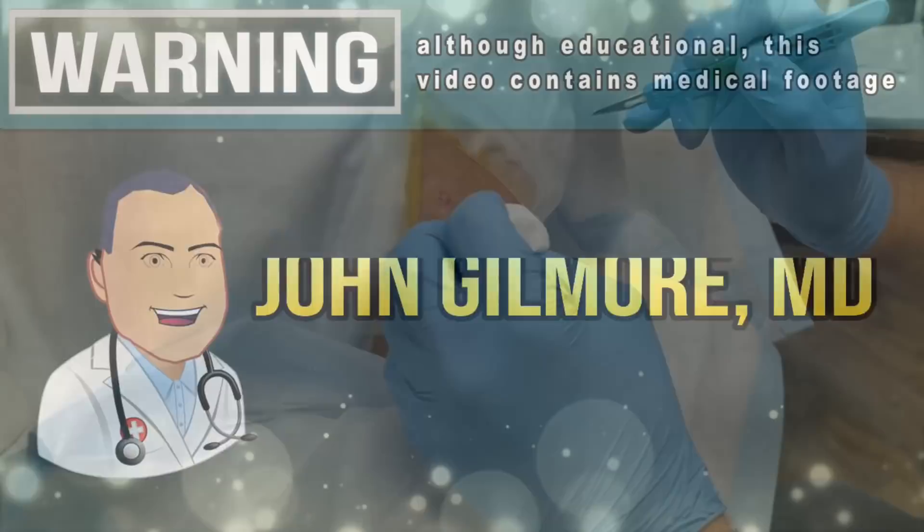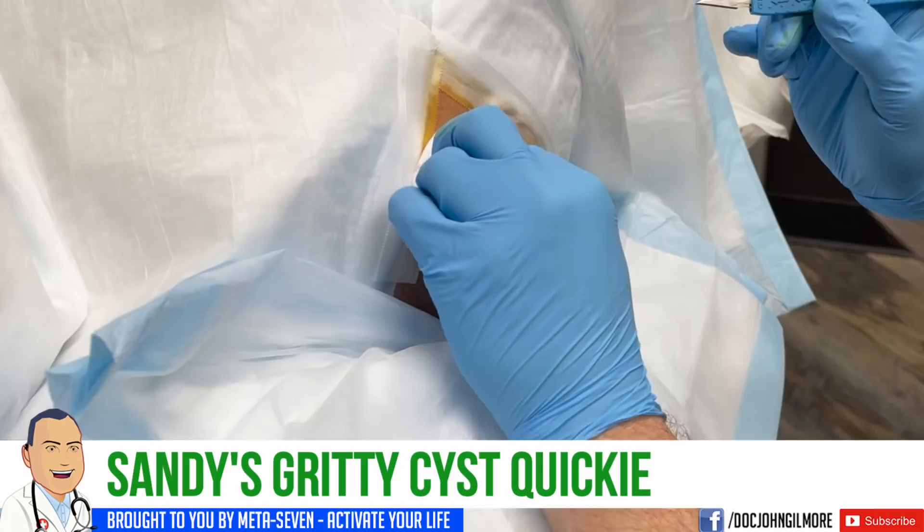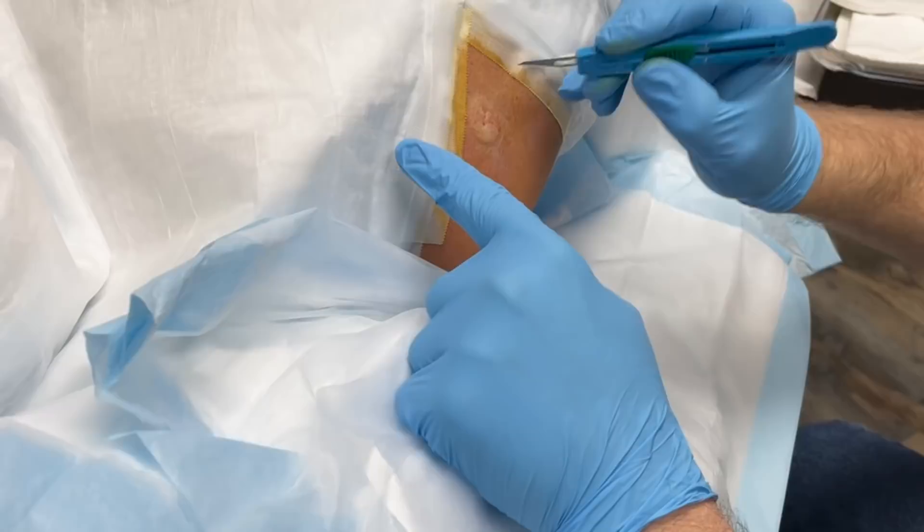So we're going to go — the arm sort of runs like this. You want to watch? You're not going to be able to. No, I can't watch. So try to relax, okay? You're not going to paint on me, right? Yesterday was a different story. Okay, so we're going to make the incision right here.